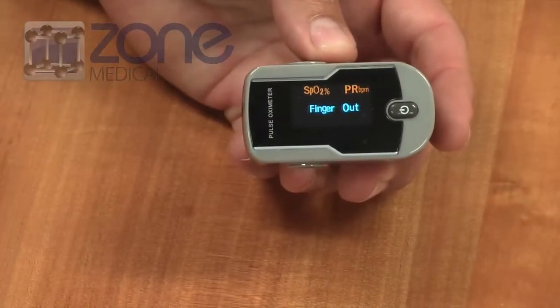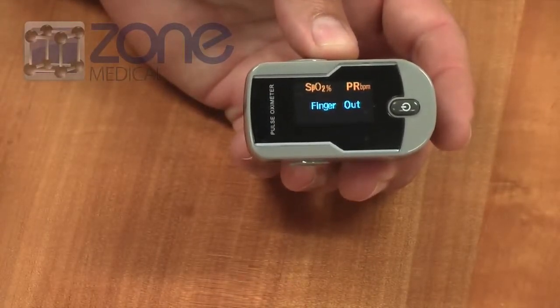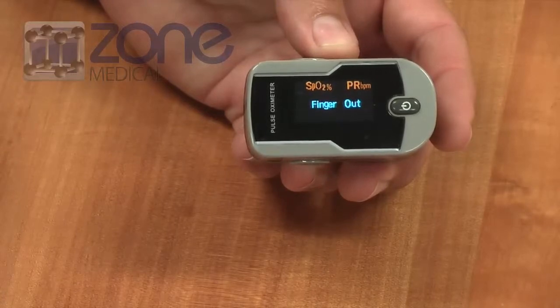To turn the machine off, you take your finger out, and within a couple of seconds it'll automatically turn itself off.